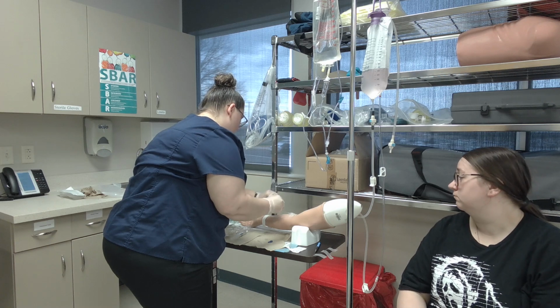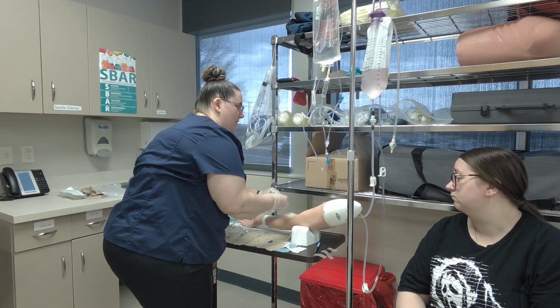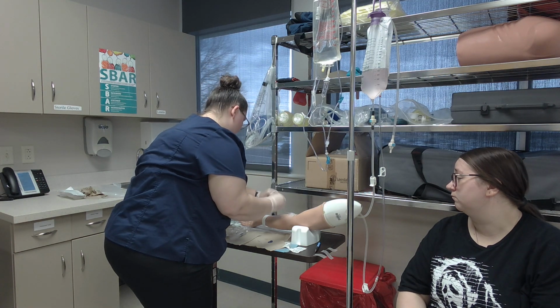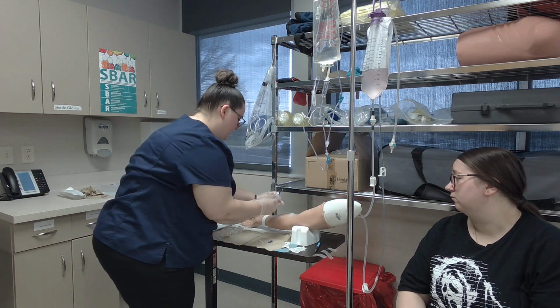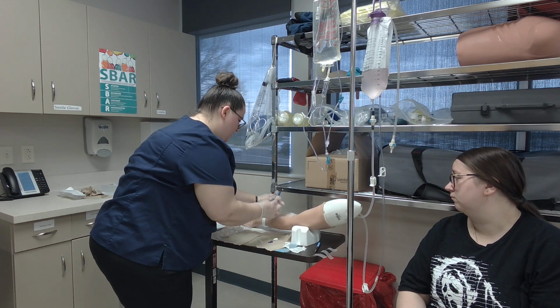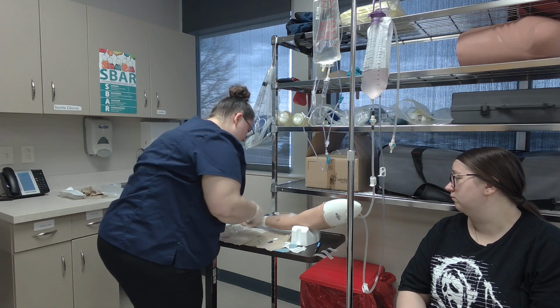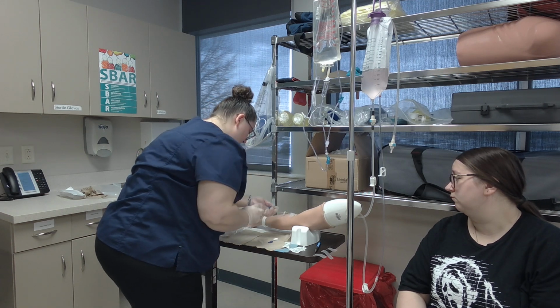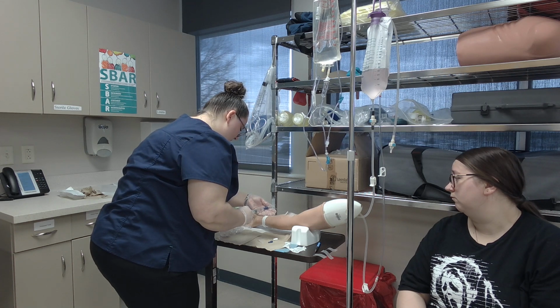And also notify, oh yeah, I said notify and document everything. Okay, so there's my 30 seconds. I'm going to take my IV flush, connect, opening the clamp here, and I'm going to use the push pause method and insert 3 ml.